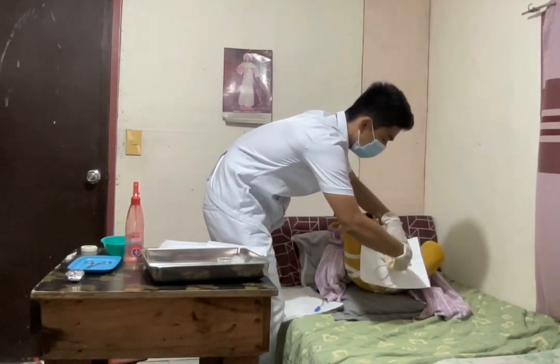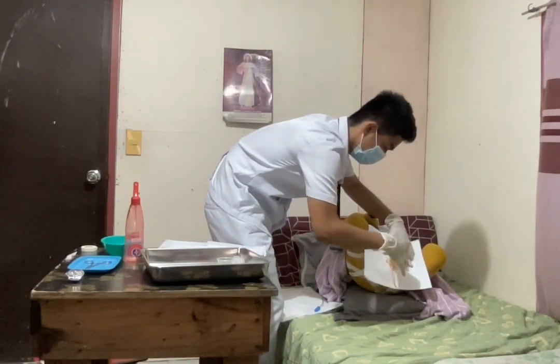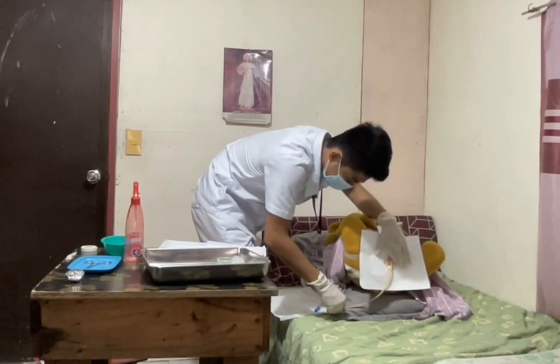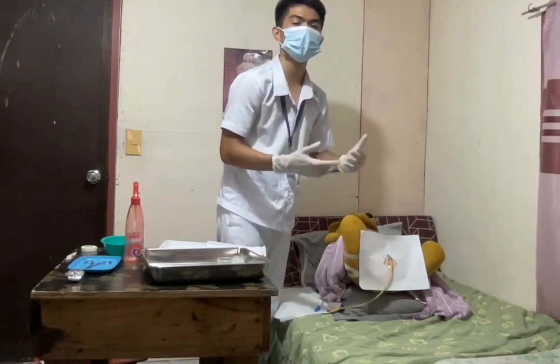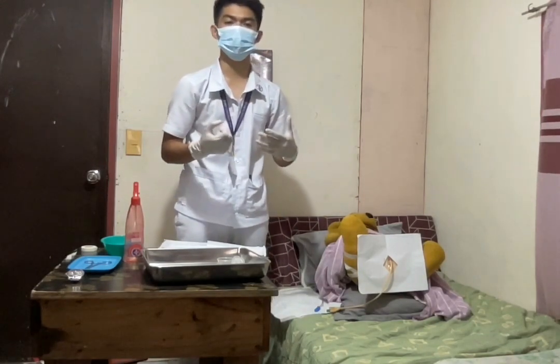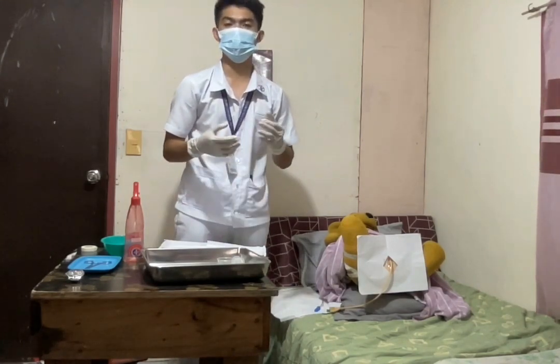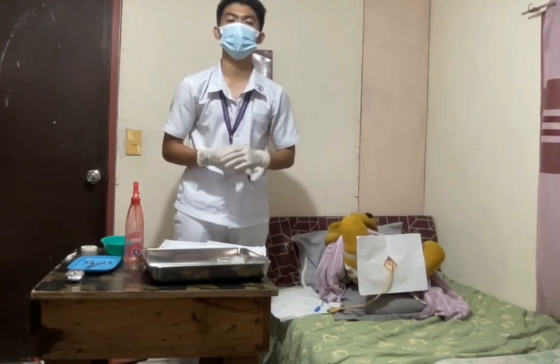Safely, just like this. This safely places the catheter in the urinary tract to facilitate urine drainage. If a specimen is to be collected, pinch the catheter with the thumb and the finger while placing the specimen container in position. This is done if necessary to collect a urine specimen if required while maintaining catheter placement.